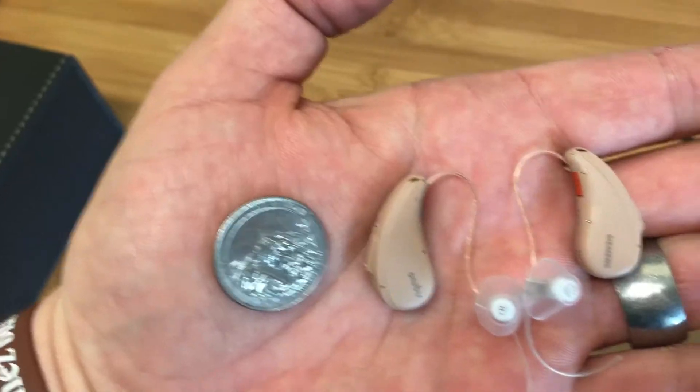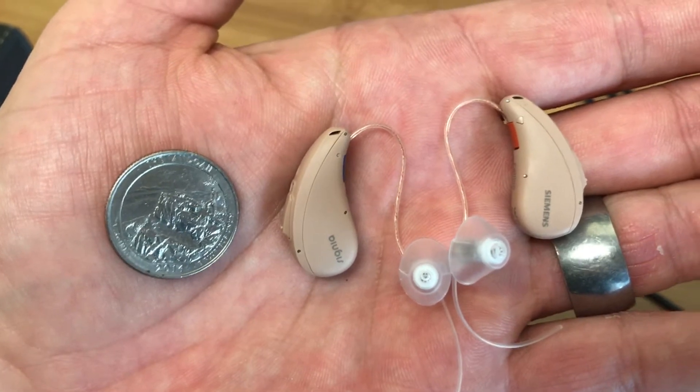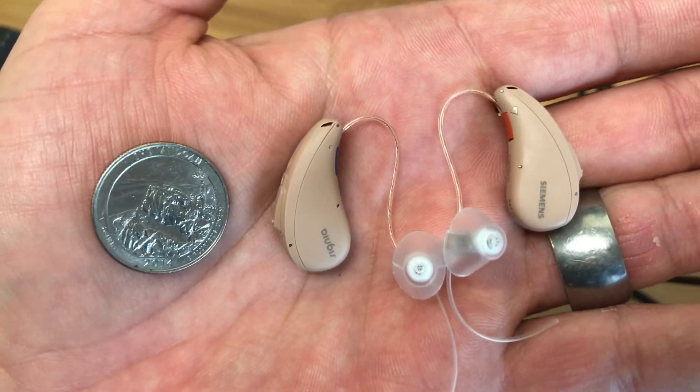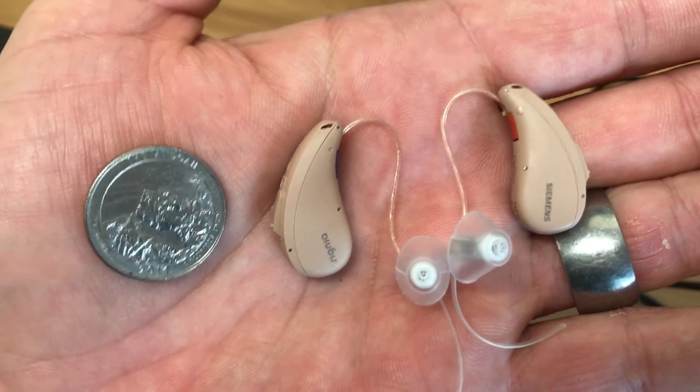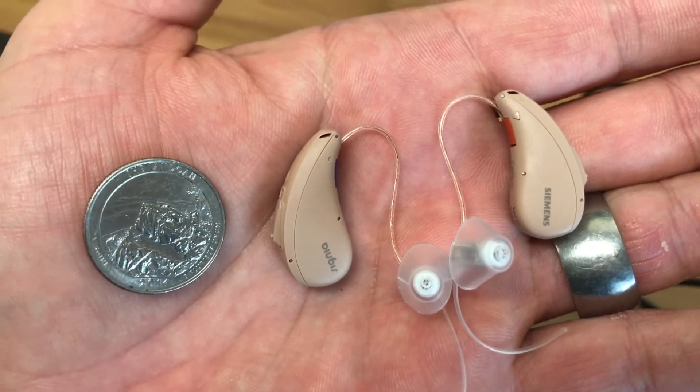Hello, this is Nathan with Soundscape Hearing Aids making a quick video to show you a pair of the hearing aids we have here. So here we have a pair of the Signia Siemens Cellion 7 Primax. I've got a quarter next to them there to give you an idea of the size of the hearing aids.